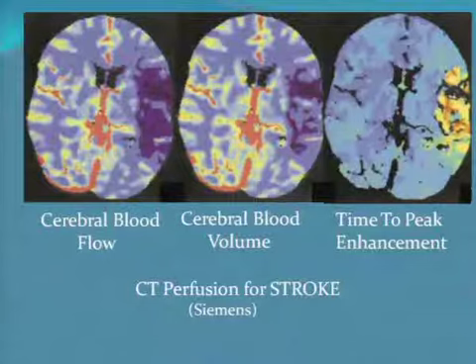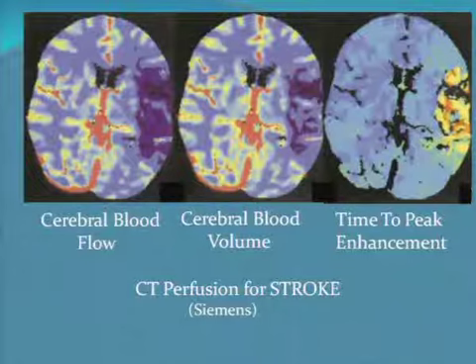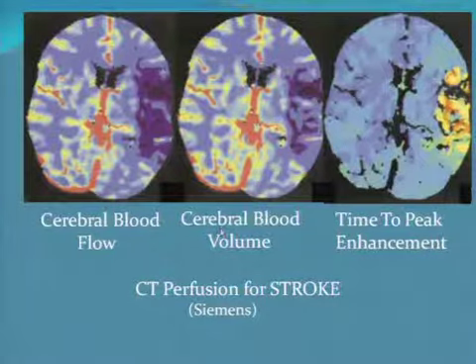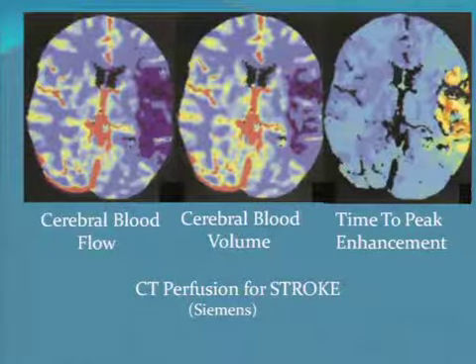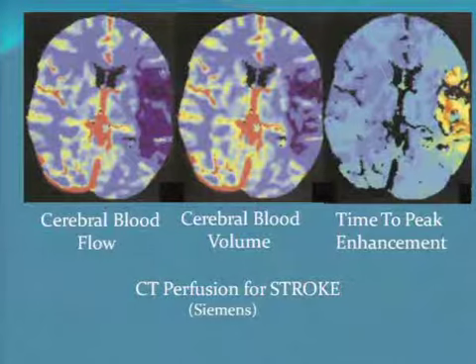It's more commonly used in stroke. I pray that I never have a stroke at my place of work or break my arm or do any of those normal things because our emergency room is totally not geared up for normal stuff. We just do cancer. But this is how someone with a stroke in a certain part of their brain looks after CT perfusion. And this exam tends to be very temporally important. There's a time window where once you get this information, you can make appropriate treatment decisions. If you wait too long, your treatment options kind of go away. And so the ability to do this study and do it really quickly is really important in those centers that offer this.